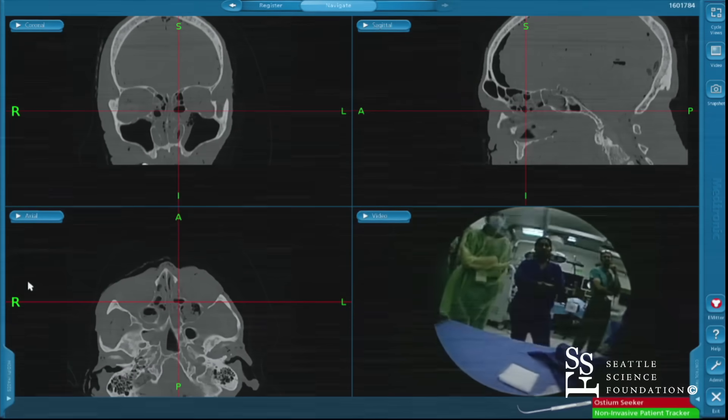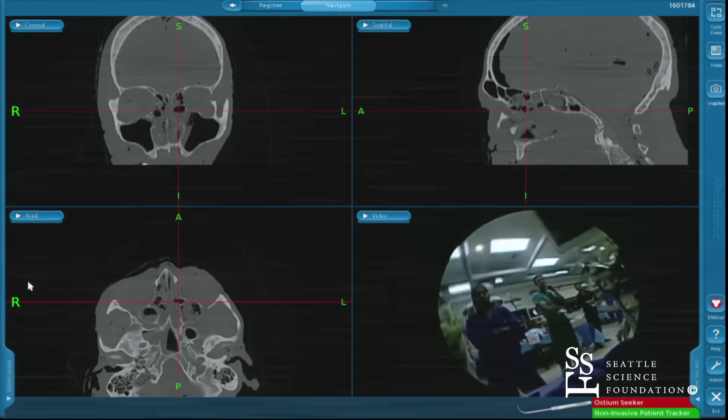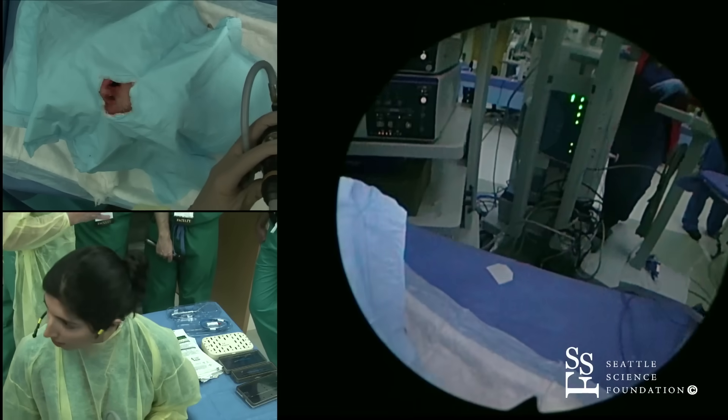Some people prefer 45-degree scopes or 70-degree scopes. I always start with a 30, and then if I feel like I need any more visualization, I usually go straight to a 70.